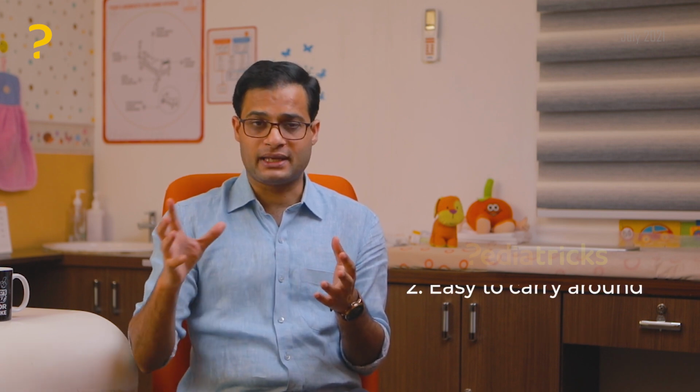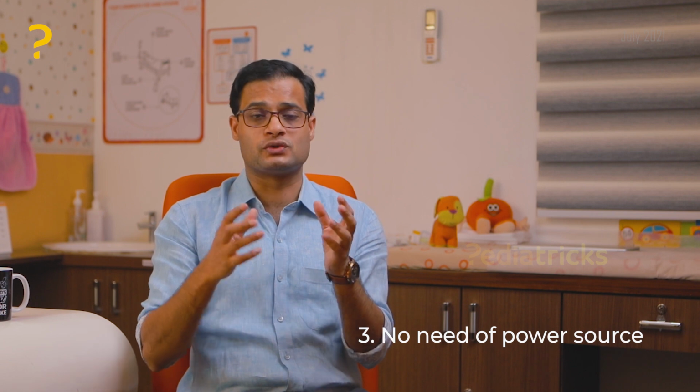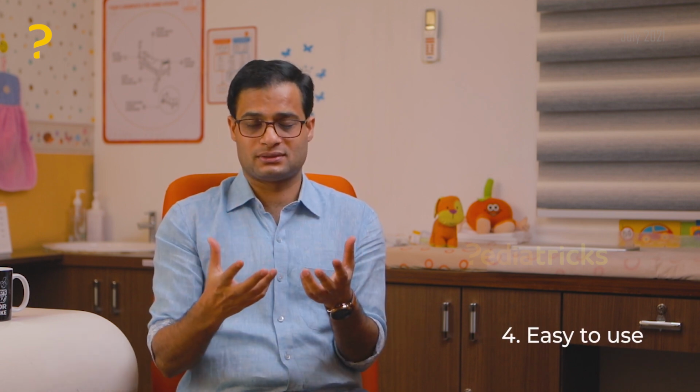The advantage over a nebulizer is that it can be carried along with you. It can be used anywhere, and you don't need a power source. Once the child is comfortable using it, they can use it without much effort, and they are also quite comfortable using it because it gives quick relief. They don't mind using it repeatedly if a need arises.